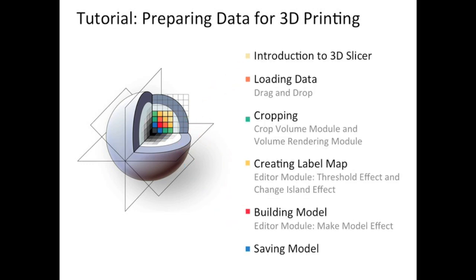We'll start with an introduction to 3D Slicer for those of you who have never seen the interface before. Then I'm going to load data into Slicer using drag and drop. After that, I'm actually going to crop down my cone beam CT to a sub volume that contains only the region that I'm interested in. Afterwards, I'll use the editor module to create a label map in which I segment out the bone part of that sub volume, because I want my 3D printed model to only represent the bone. Then I'm going to create a surface model within Slicer from that label map, and save it in a file format that's compatible with my 3D printer.